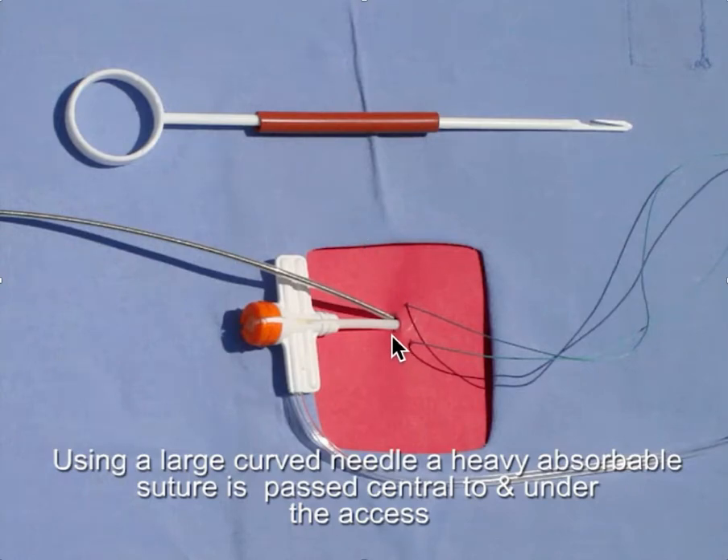If you have a lot of bleed back around where the sheaths or the leads are entering the central venous circulation, this technique is very helpful in reducing that bleed back. This may also occur following venoplasty when you see the balloon tail — the inflated tail of the balloon in the pocket. But it happens most frequently when you have multiple leads through one access and high central venous pressures.